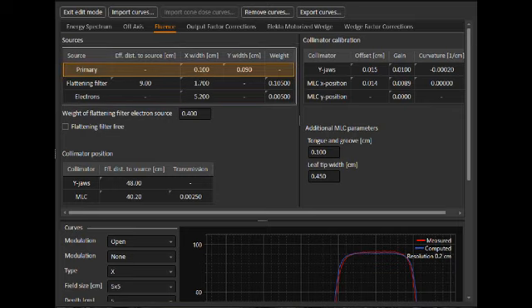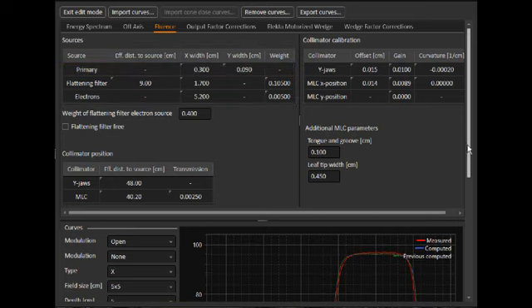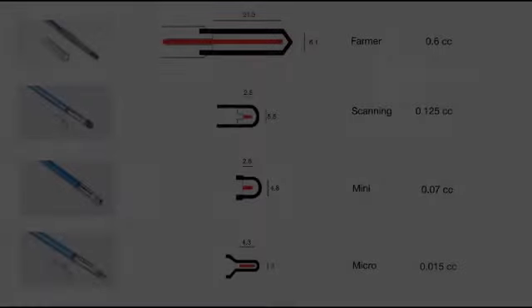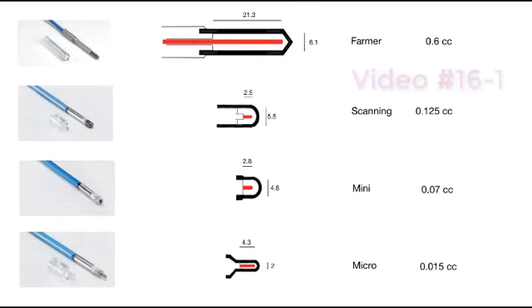All right, so I'd like to start with an example, and that is commissioning a treatment planning system. And as you'll see, this is going to be a bit of an unfortunate example. As we commission a TPS, we have to take a lot of data and measure things, measure outputs and so on. We have different chamber options to do that. And here's from video 16.1, you'll remember this.